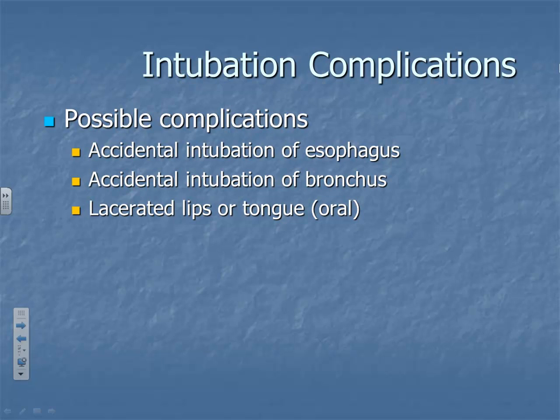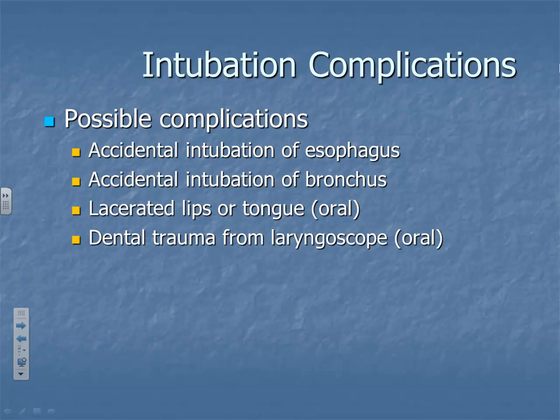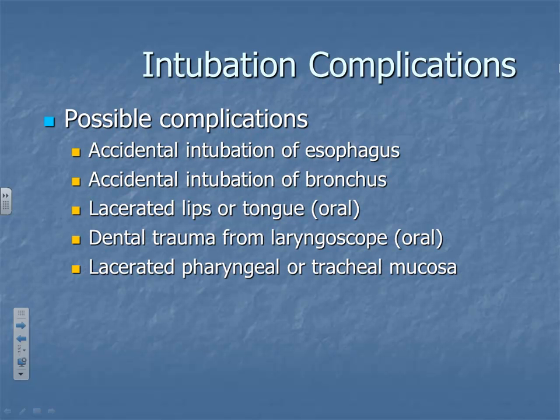Now, from time to time, you may have a patient with a bleeding disorder or somebody possibly with esophageal varices. Y'all know what that is? Is it the grossest thing you've ever seen? It's the grossest thing I've ever seen. It's where all you have to do is touch the inside of their mouth, really, or their throat with the end of that tube, and you've unleashed gallons of blood. So you need to be very careful with this and try to keep it off of the soft tissue.